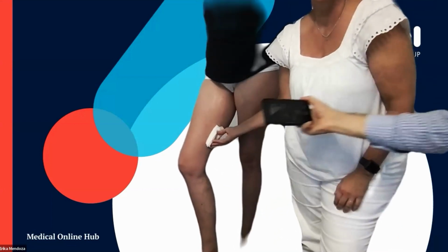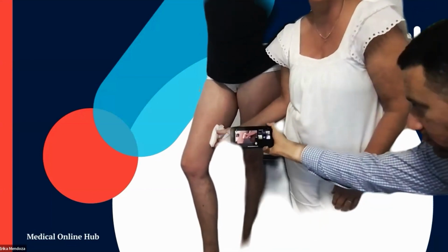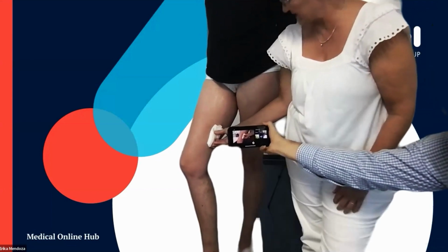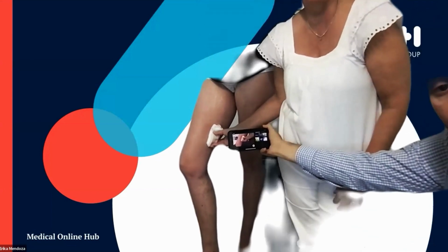You see perfectly. I have put extra compression here after the sclerotherapy to allow a better closure of the perforating vein.